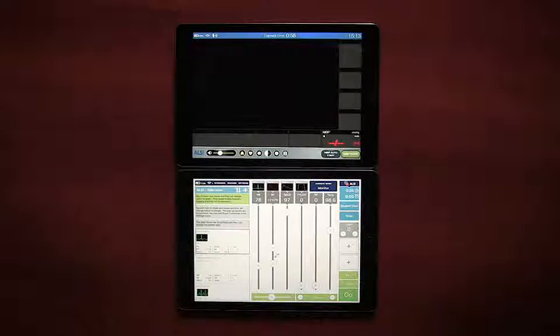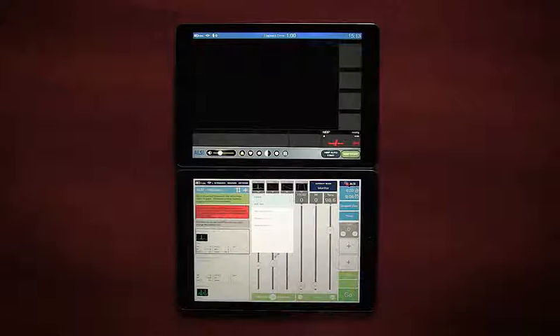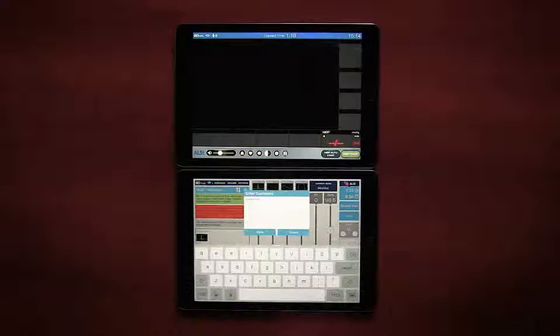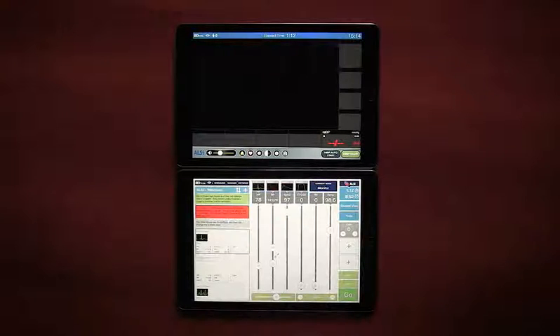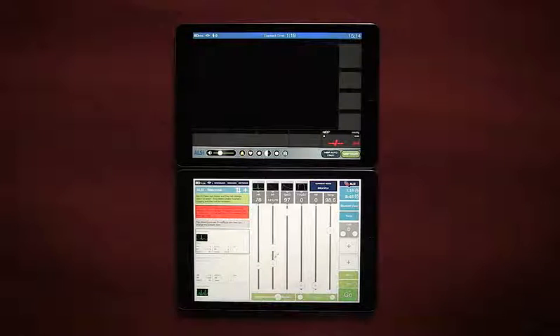As you tap the boxes, they turn from gray to green. We can tap and hold on these boxes, and it's going to bring up a screen where you could either grab some text that you've already programmed, like an incorrect dose of medication was given, or if you want to make a more detailed note, you can hit add text. It'll bring up the keyboard, you could log your note, and it will save that in the log that's running in the background.